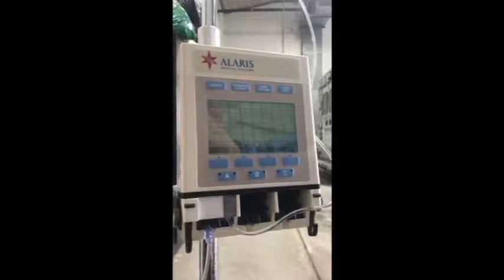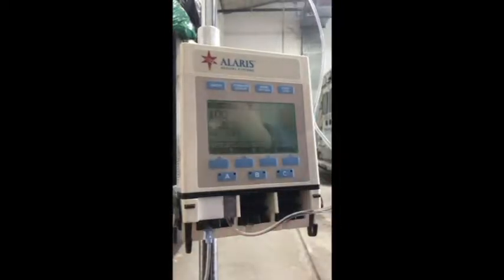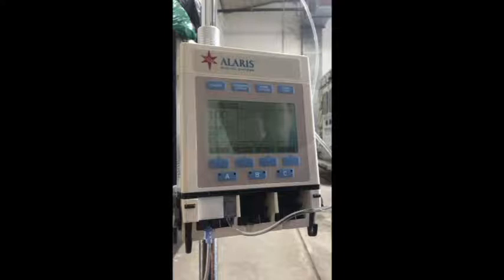Always read all of the directions. Patient site occluded, clear occlusion between channel and patient IV site. Press start to resume or cancel to clear alarm. So I go and I look, and lo and behold, the patient kinked their arm off. Now I cleared the alarm, and you can also start it from the home screen. You just have to be highlighted. And now we are once again infusing.